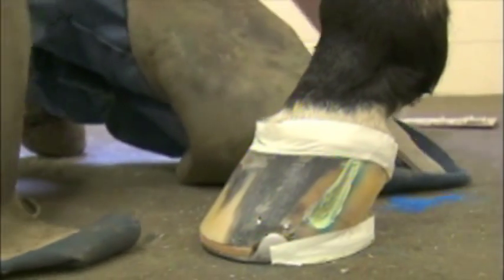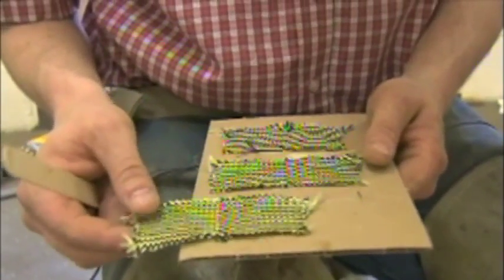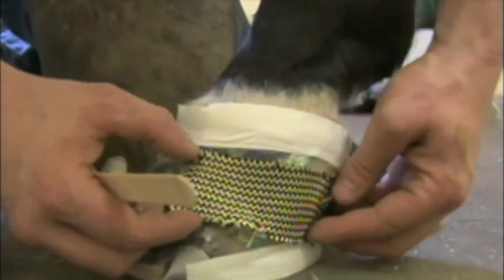For this, you can either use fiberglass fabric, or in this case we're using a carbon fiber and Kevlar mesh — it's just a little stronger. I'll take about three strips and cut them about the length we want to bridge the crack with.